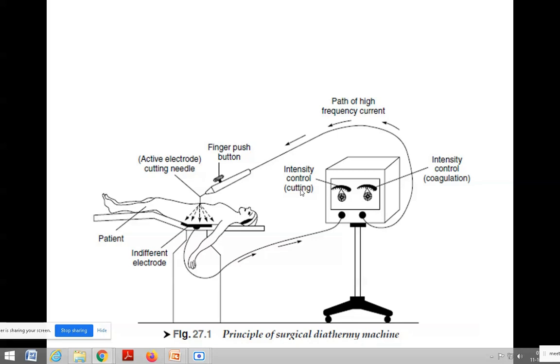Okay, you will clot the blood. So the intensity value will be maintained. Based on the intensity value, you will be giving the signal, or heating effect, to the affected area of the body, the affected parts or organs of the body.